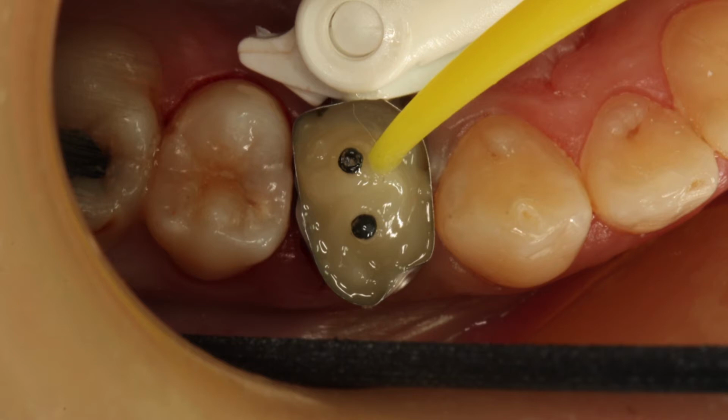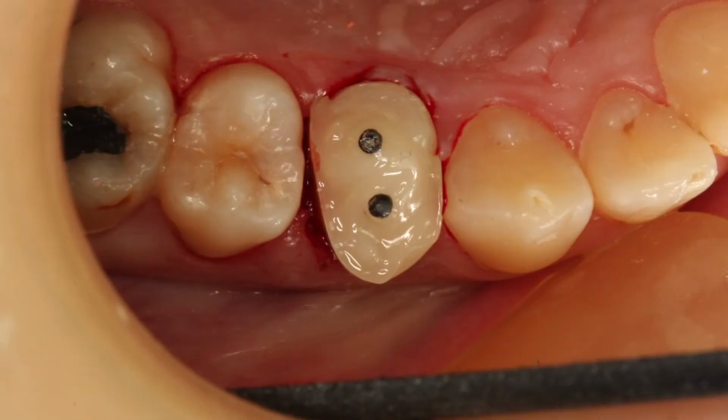And it's even better if the angulation happens to be they kind of cross over like an X at the top and get a little more mechanical retention there. Yeah. But that wasn't a difficult buildup for you to do. I could tell that it took just mere minutes to go through and do that. 5-6 minutes, and that's done, ready.